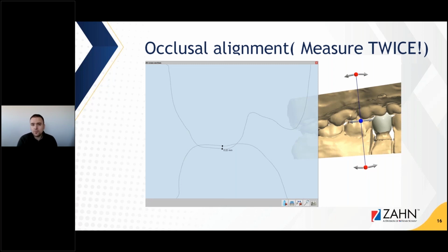So if you already use preset settings to, let's say, make your design 0 into occlusion, this is actually going to make your design out of occlusion, because by the time that jaw really closes, your crown is already out. So when we don't have recourse to rescan and realign, we measure that distance and incorporate it into our design.